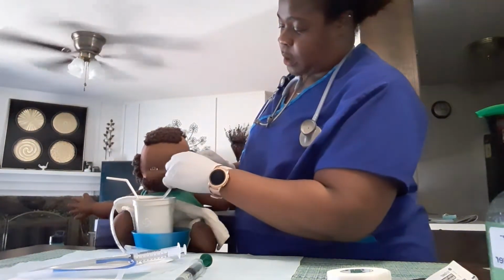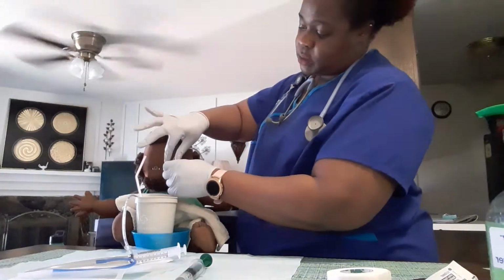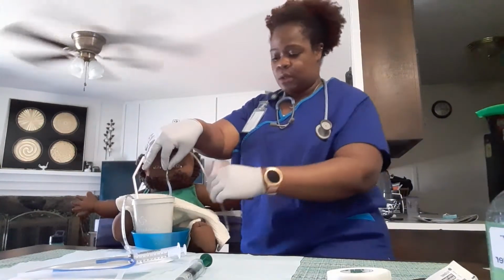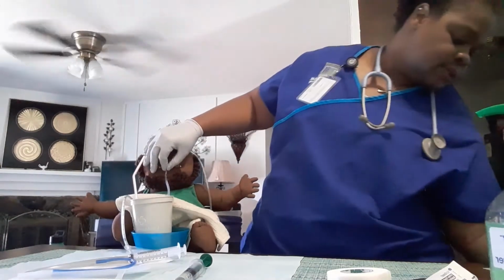Okay. And I've gotten to the 35. I'm going to hold on to the tubing here because it is in his nose. I'm getting some greenish bowel content back.